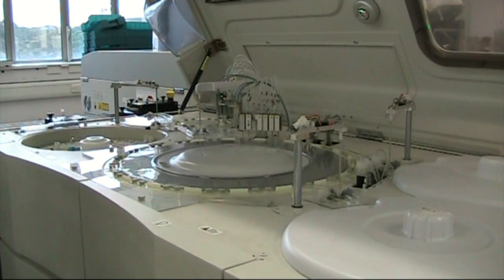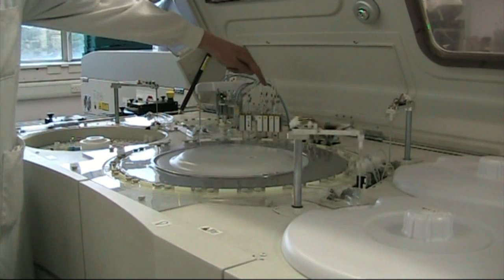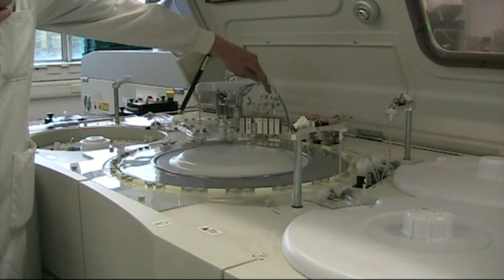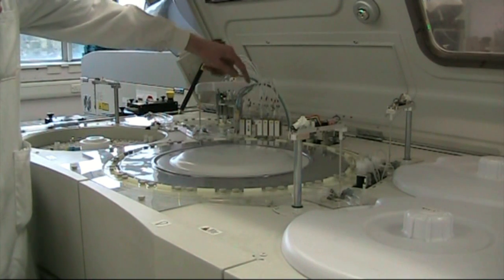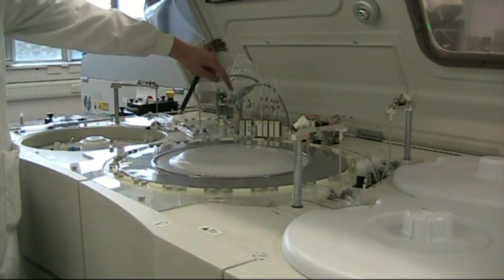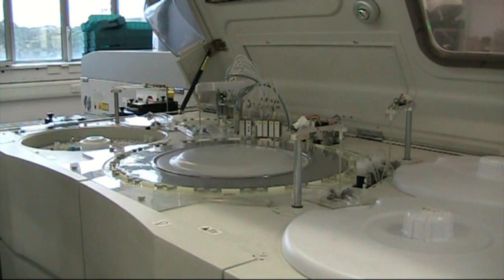After each cuvette's used, at the end of its 10 minutes, it's washed very carefully. So this is a wash station which is cleaning cuvettes. They get an acid and an alkaline wash, and then a water wash, and then they're hoovered out very carefully so that the cuvette is clean and dry before it's used again. And it actually shines a light through that cuvette to check that it's clean.